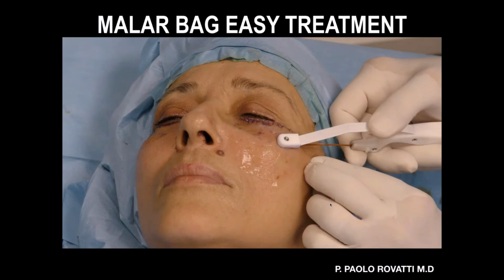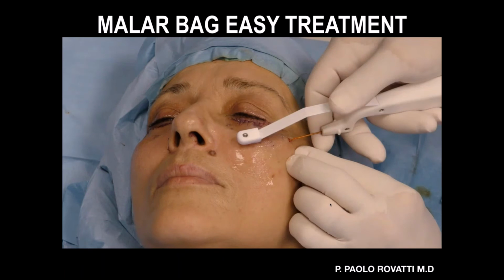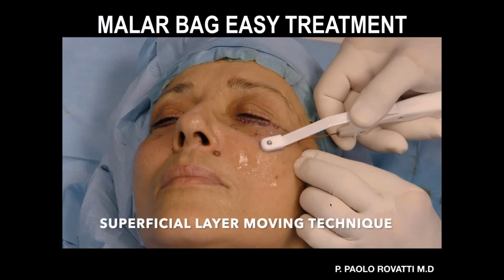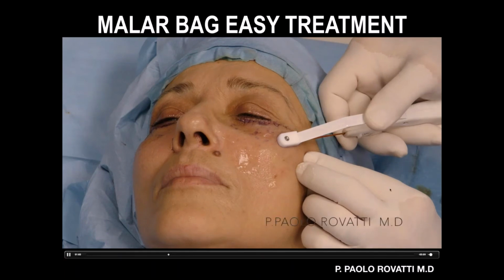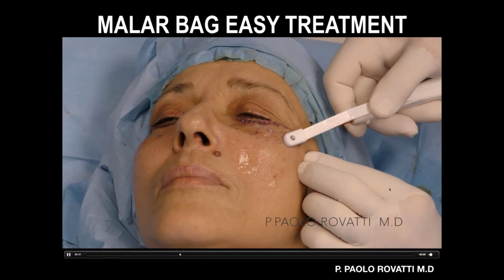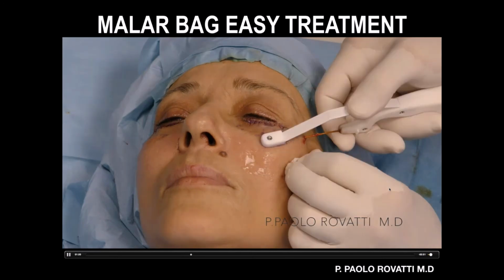But usually I use dual plane even here because I'm doing stamping or stopping, call it as you want, going deep, and I'm treating the fat. And after I'm doing a superficial moving backward technique. So usually we don't need so much heating. Usually 0.2, 0.3, 0.4 kilojoule is really 5 minutes of treatment, and that's enough to have a contraction of this tissue and sometimes to reduce the malar fat bag, but usually it is really a great problem. So I show you this case.